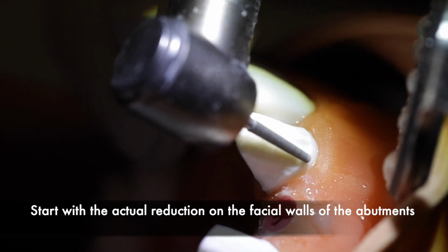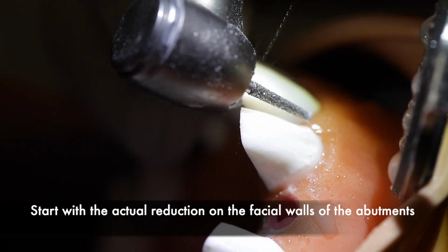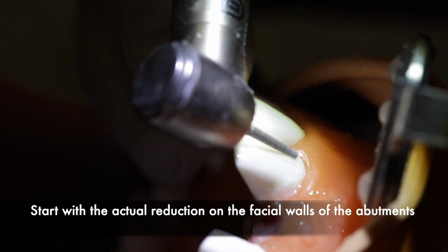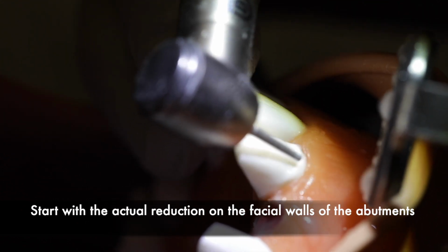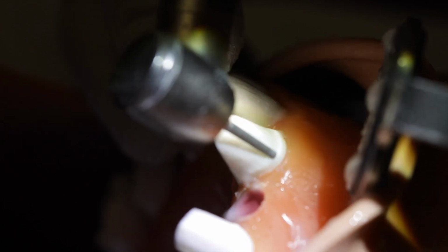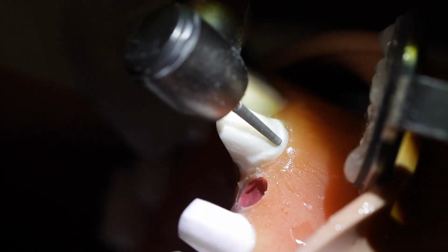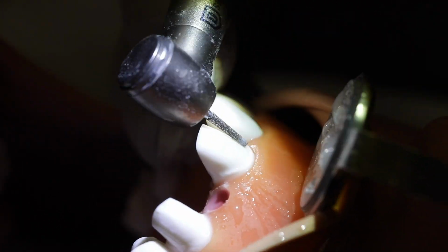After this, I start with my actual reduction. I start making depth grooves on the facial of each preparation, and I connect those depth grooves. I go a little bit shy from the actual depth that I need, so that way I have range to correct if I need to.